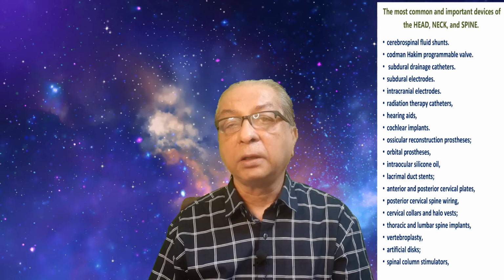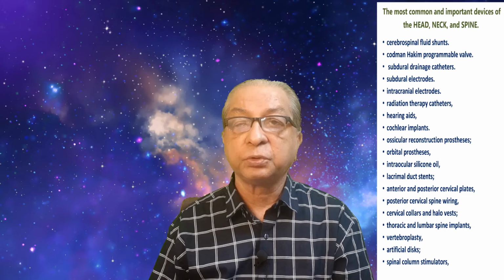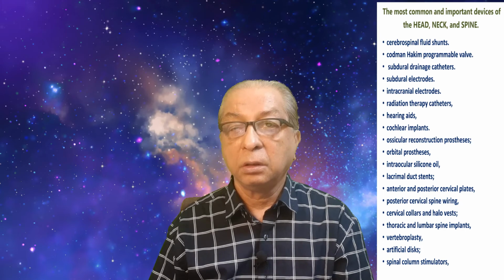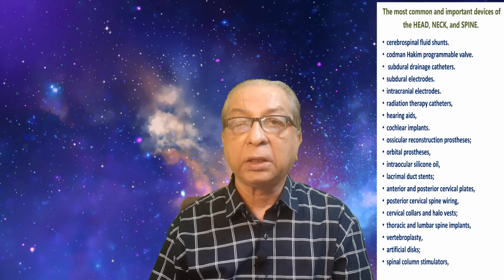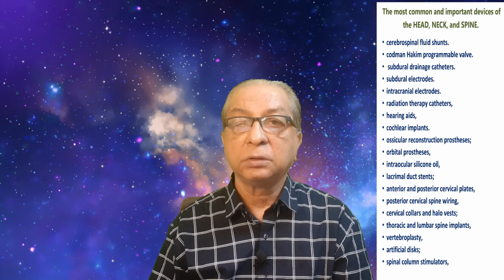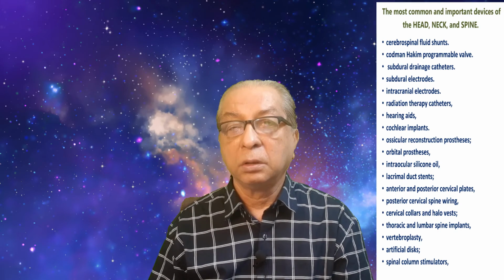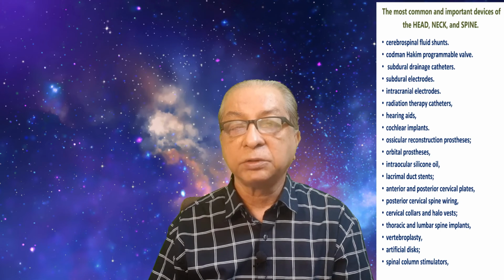And in the neck there are anterior and posterior cervical plates to retain the broken or weak cervical vertebrae. So these plates support the cervical vertebrae and give a good posture to the patient and support to the cervical spine.